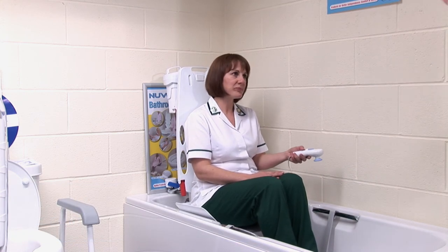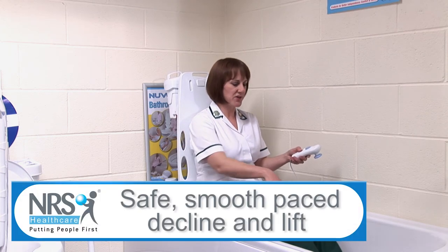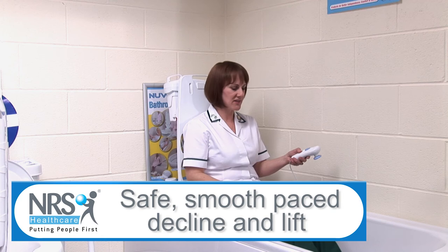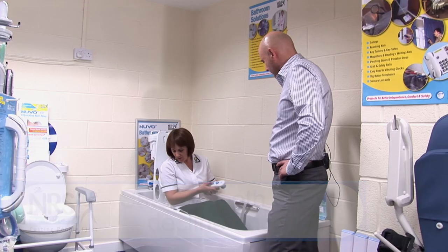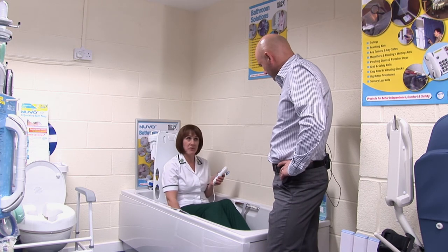It moves at a fairly reasonable pace as well, so it's not plunging you straight in. It's not jolty — it's nice and comfortable and smooth, and it gives you time to put your legs out in front of you to begin stretching out in the bath. That's when you reach the bottom — you're about 10cm from the bottom of the bath there.